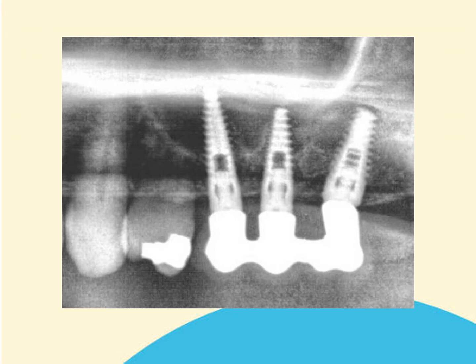These are again examples of series 2 type connections. There is no space between the abutment and the implant. The implant abutment interface is quite easily discernible. There's no space existing here. The abutment fits quite flushly on top of the implant. And also, this particular implant is platform switched.